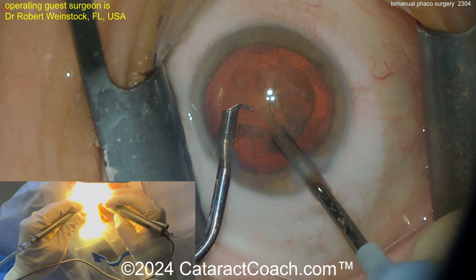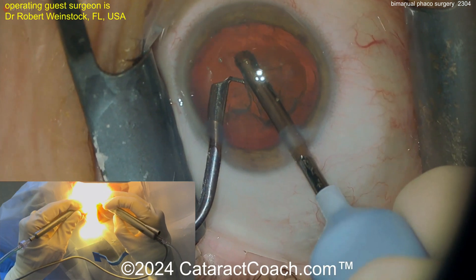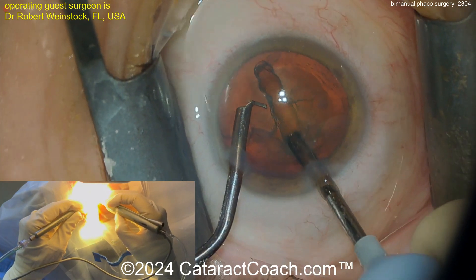Look at the left hand — that's an irrigating chopper. The right hand is a phaco probe with the needle but no sleeve. Creating a groove down the middle.